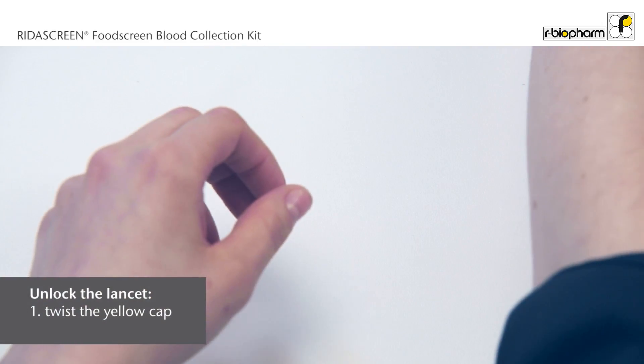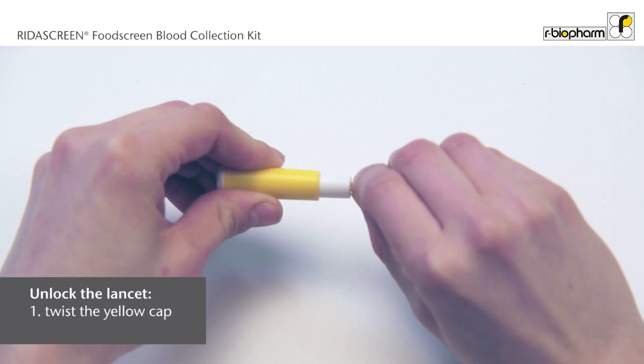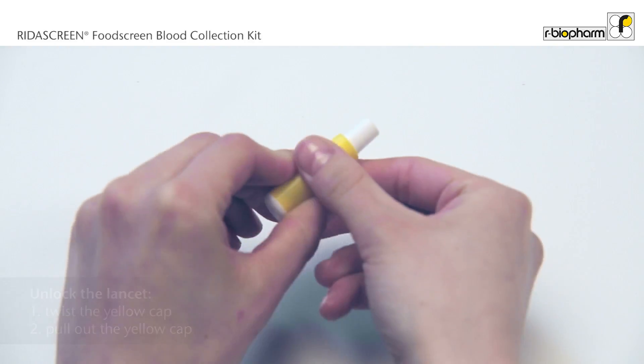Prepare the lancets: twist off the yellow cap from one of the lancets and pull it straight out. Do not activate the lancets prematurely by pressing the white area of the lancet.